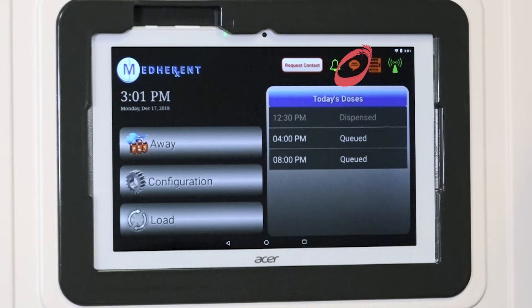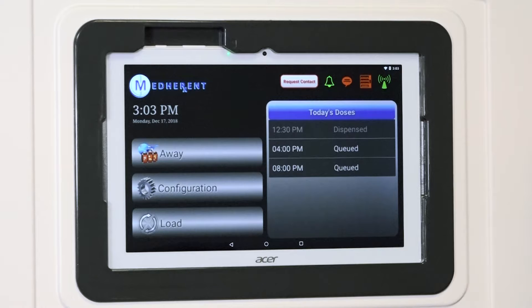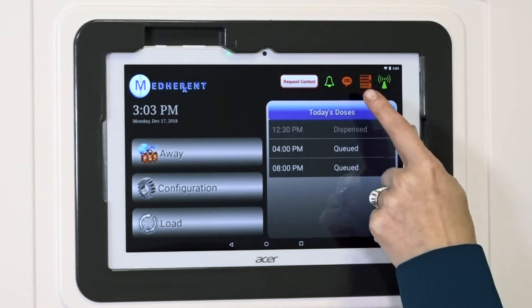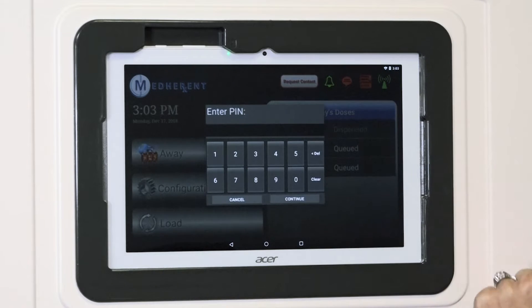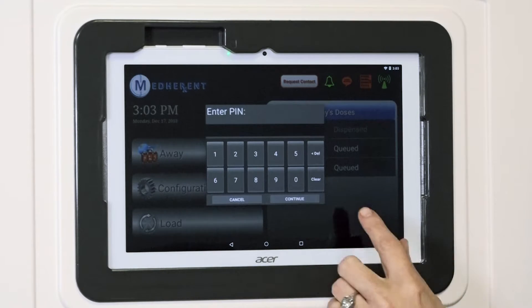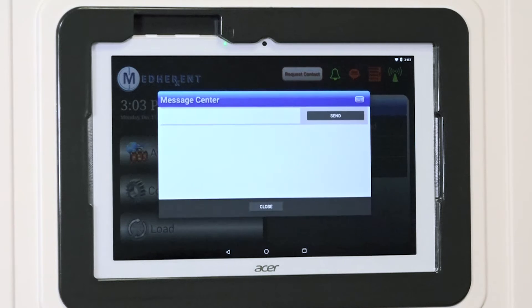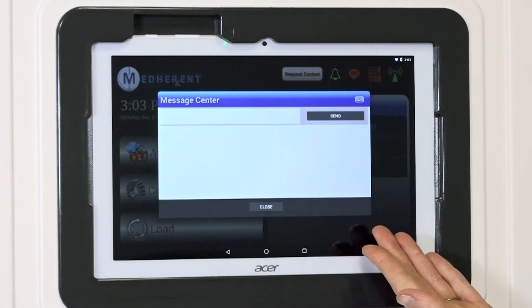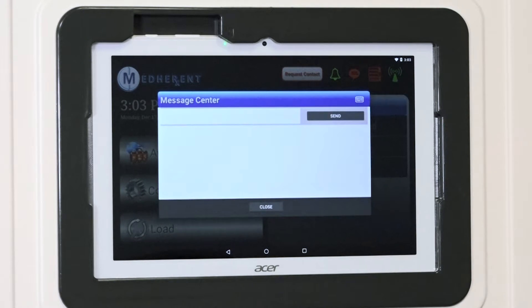This icon looks like a speech bubble because it represents a way for caregivers to communicate with Terrapin Pharmacy staff through the Medherent system. This communication function represents a future capability that we are working to roll out in the coming months. This function will operate like a text message. All caregivers need to do is tap this icon and enter their administrative pin. Use the on-screen keyboard to type and submit a message. If the keyboard does not automatically pull up, then tap the keyboard icon in the top right.